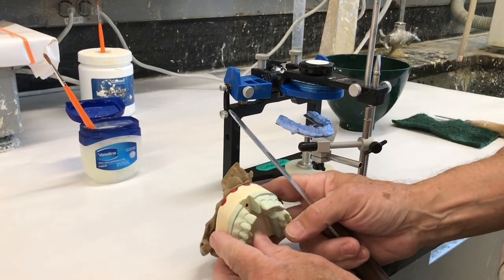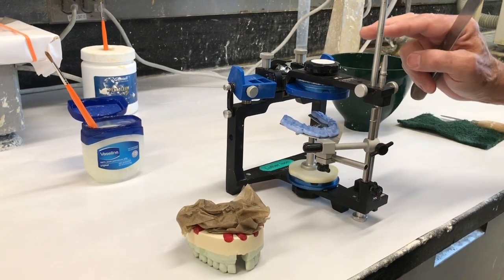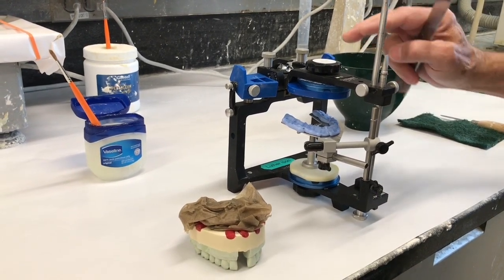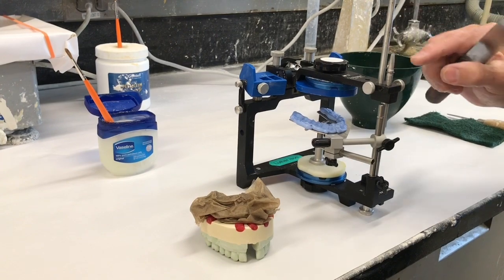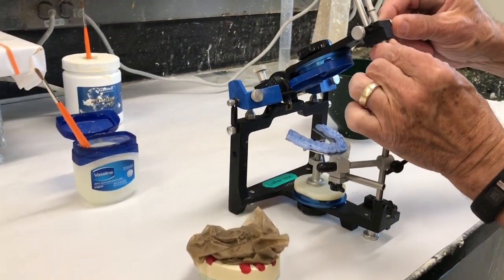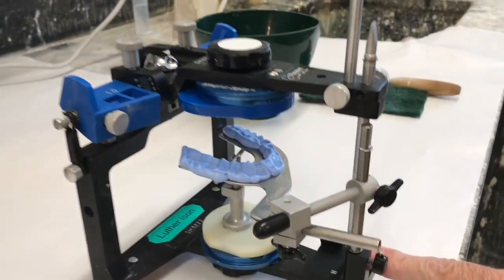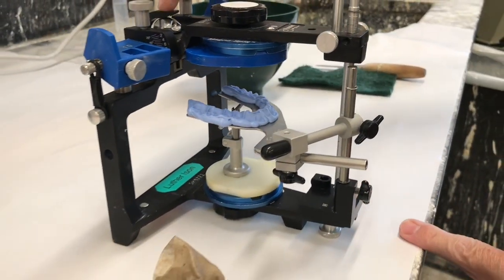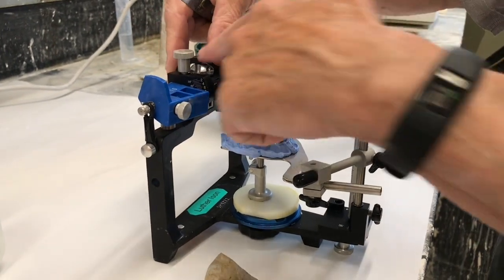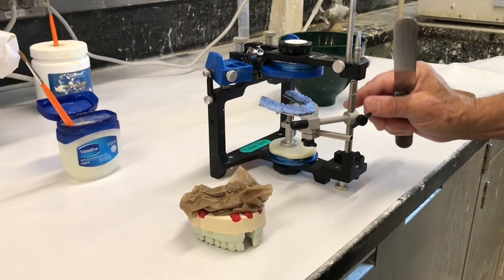Now we need to mount this master cast to this Panadent articulator, semi-adjustable, that we use here at the U of M. It's set up so that the pin is where it's supposed to be, flush with the black line, fully seats on the table here, and the centric lock is locked back in this posterior part so that it can't slide into any excursives.